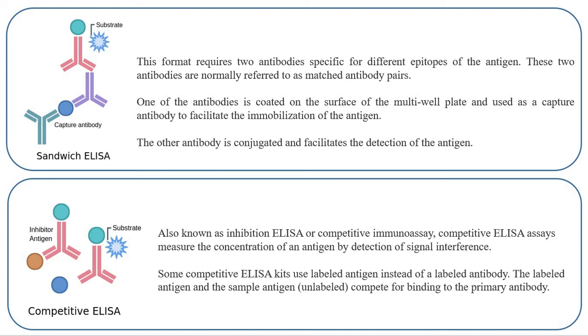A low amount of binding could indicate a high level of target analyte in a sample. The signal inversely correlates with the amount of analyte, such that if the concentration of the target analyte is high, then the reference signal is diminished through its competitive binding to a limited amount of labeled antibody.